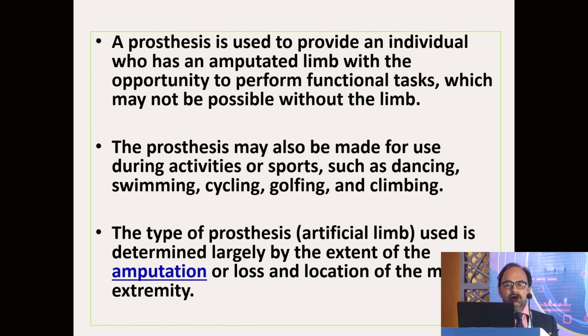So the definition of prosthesis we already know. Prostheses may be used during activities and sports such as dancing, swimming, cycling, golfing and climbing, and this is mainly determined by the amputation or loss and the location of the missing extremity.